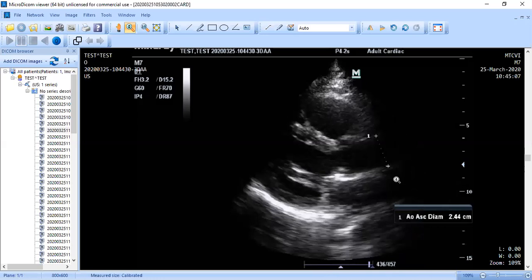All right, moving forward, then we're going to slide up a rib space or two. We're going to elongate this aorta, and then we're going to measure the ascending aorta up here, okay? You want to be up in this area, so we know we're in the ascending. We don't want to be down here because this is still kind of the aortic root.